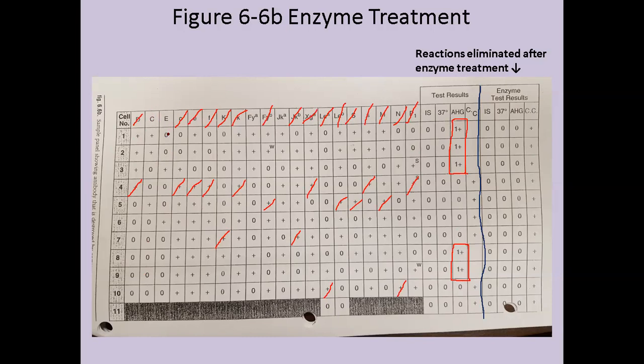Let's move on to big E. Negative, negative, positive, positive, that doesn't fit. Positive here with a positive, that one fits. Then we see positive, patient's not reacting. The pattern for big E doesn't fit either.